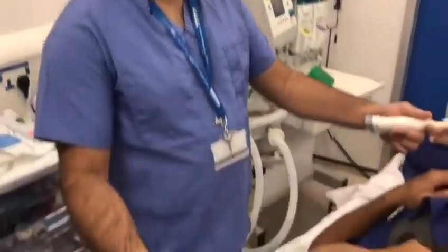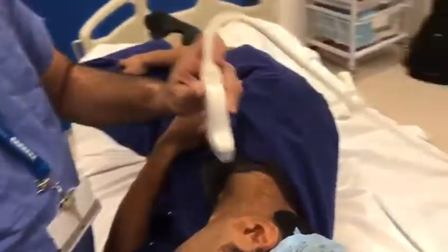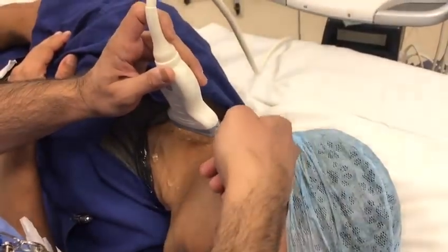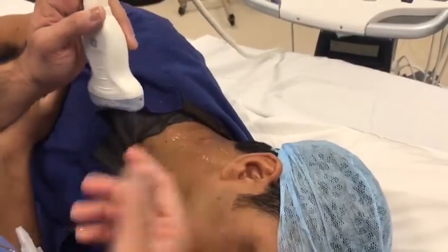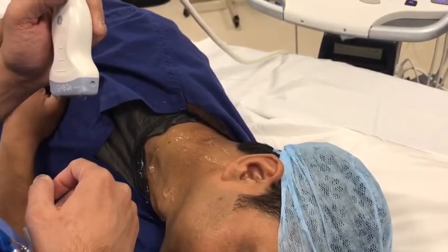In order to perform these blocks, the ergonomics is very important. I have a patient lying on the side and facing towards me. I have the ultrasound machine focusing on the opposite side, and my approach to these blocks is out of plane. You could perform an in-plane, which is a Korean technique that has been described, but out of plane going from anterior to posterior. The reason I prefer going from anterior to posterior is because then you can avoid the important structures like the vertebral artery and cervical nerve roots.